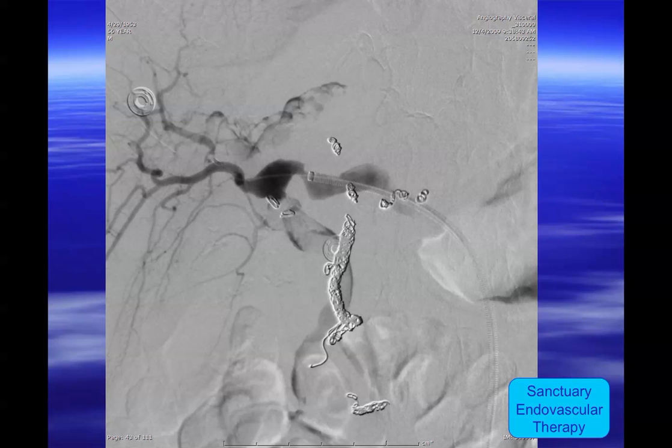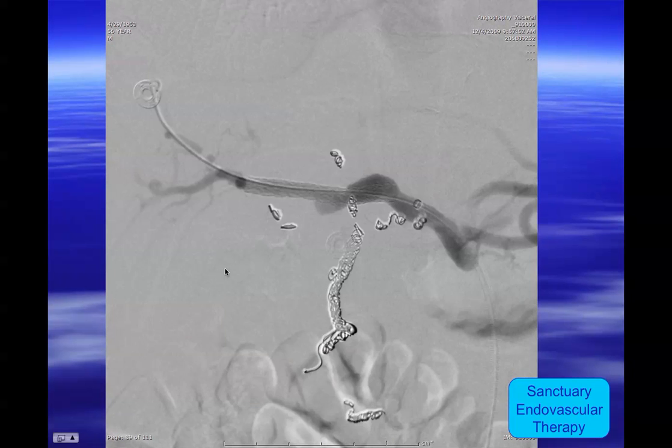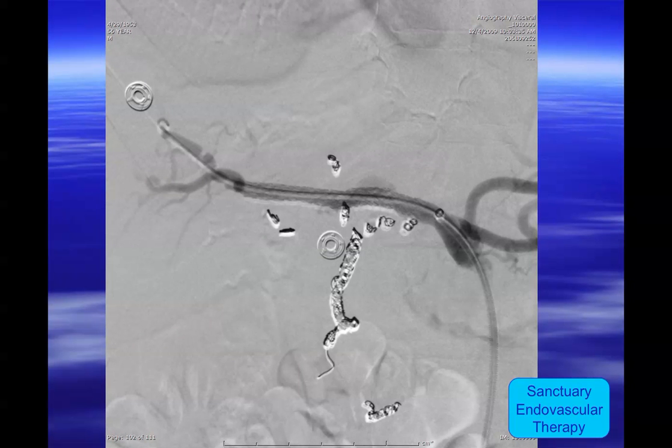So when I went in to stent graft the hepatic artery, I changed the configuration of the artery and filled his bile duct with blood, thus demonstrating that's where the problem was. And so, again, an example of stent grafts in the treatment of people who have active bleeding. He left the hospital stable 9 days after the procedure, after having been transplanted emergently, hypotensive.